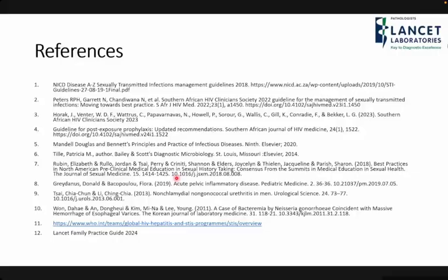That's how they're able to tell you that, okay, we've mapped out chlamydia. We know you can't culture it on plates, but they can culture it on cell cultures, which we can't do. We mapped out chlamydia, and it has this specific gene, and this antibiotic will not work anymore. They use tissue cultures, not the cultures that we use on plates, and they subject the chlamydia to certain antibiotics. If that chlamydia survives, they will tell you that doxycycline or azithromycin will not work against this chlamydia. That's why they have all this data. But the only laboratories that can do that are laboratories like NICD. It's research laboratories, and we can't do that. So with our molecular assays, we don't have sensitivities.